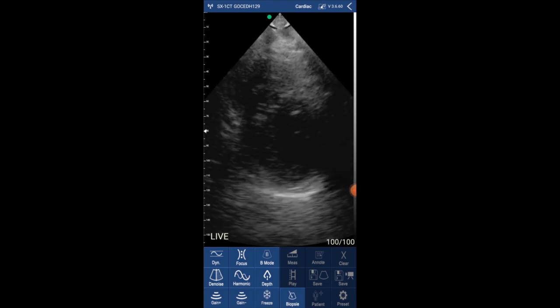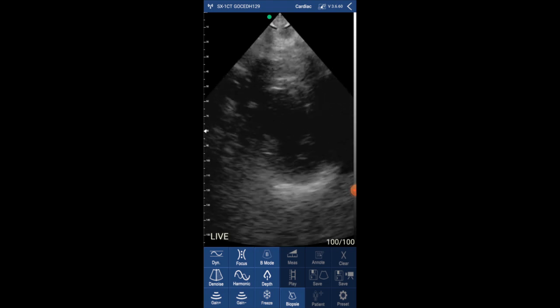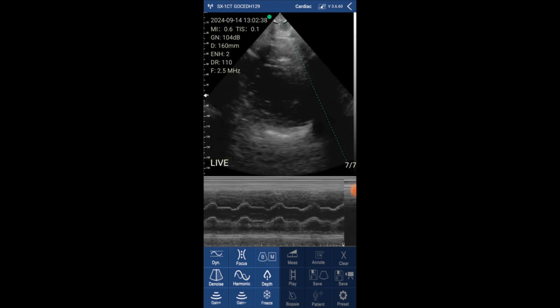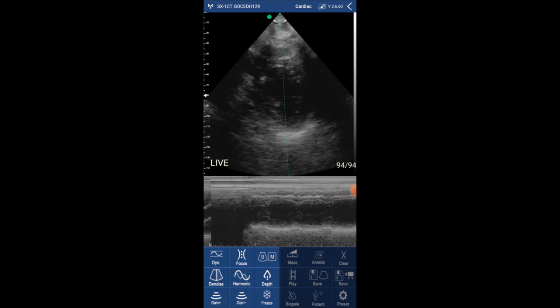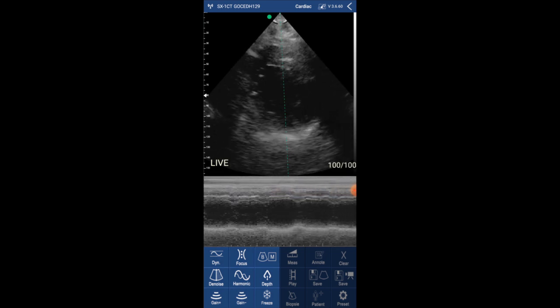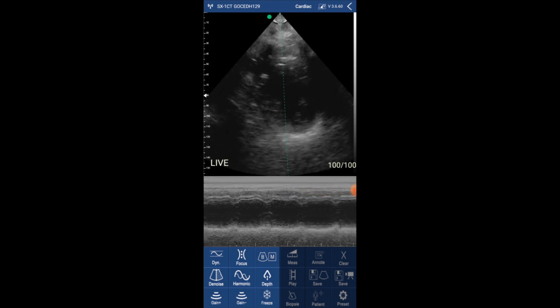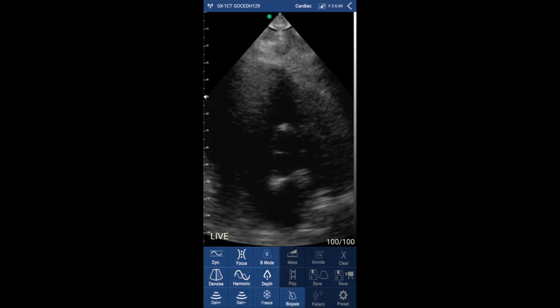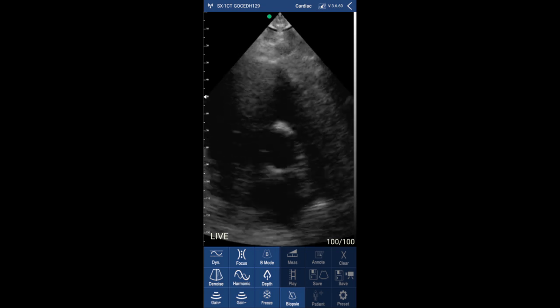Now you can see the parasternal short axis view at the papillary muscle level. Now I'm selecting M-mode and placing the cursor across the left ventricle. This M-mode also looks very nice.